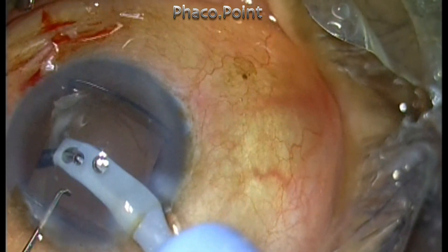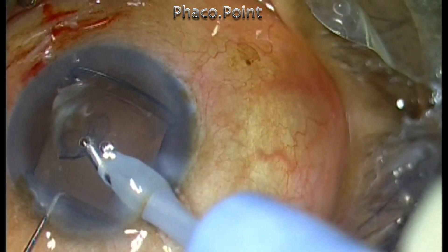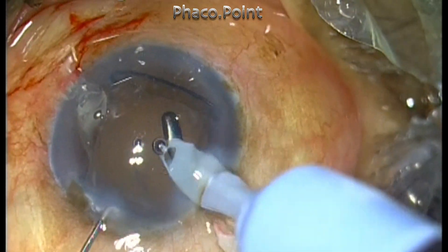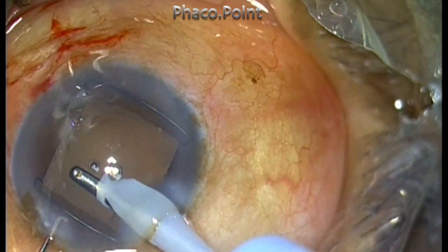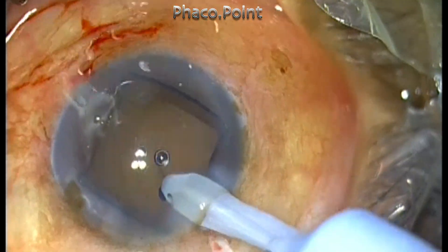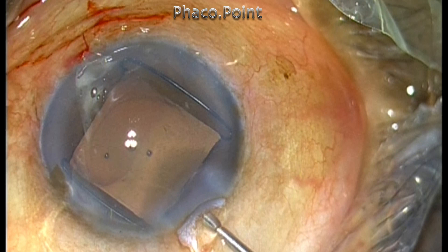The cellular debris or cellular dust settled on the posterior capsule is then removed with the coaxial I/A probe. I thought the worst part of the case — nucleus management — was over, and now all I needed to do was implant the intraocular lens to finish the case.